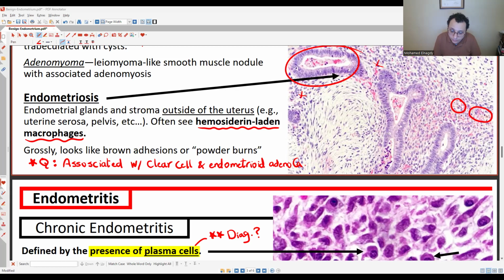If you see an area and the clinician or the surgeon, the gynecologist, is sure that this is an endometrial implant, and he gives you a biopsy and says, rule out endometriosis, and he calls you, I'm sure this is endometriosis, and then you look under the microscope and you see only hemosiderin-laden macrophages. You didn't see anything else. Is it enough to call it endometriosis? So what do you do if it's not enough? Hayek gave me a good call, which is we need to do CD10.